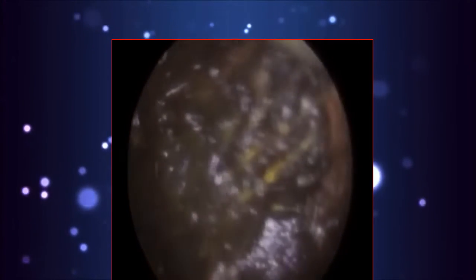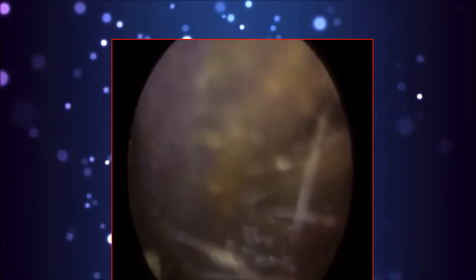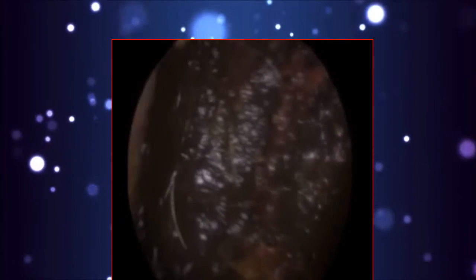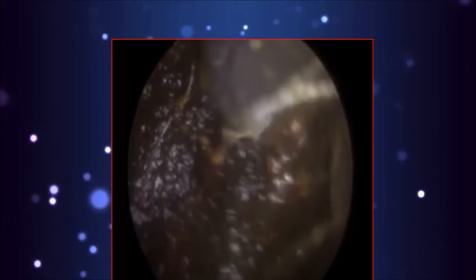The patient had been using, I believe, some hydrogen peroxide drops prior to attending. I do find that hydrogen peroxide drops have this effect on earwax. It makes it quite mushy, almost like mashed potato, which therefore makes it quite difficult to suction. So I think in a moment I'm going to try and change the consistency of the wax.